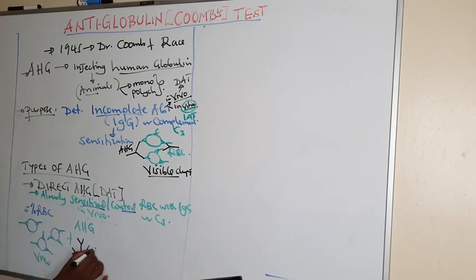And after incubating, we centrifuge at 1,000 RPM, that is revolutions per minute, for 1 minute.